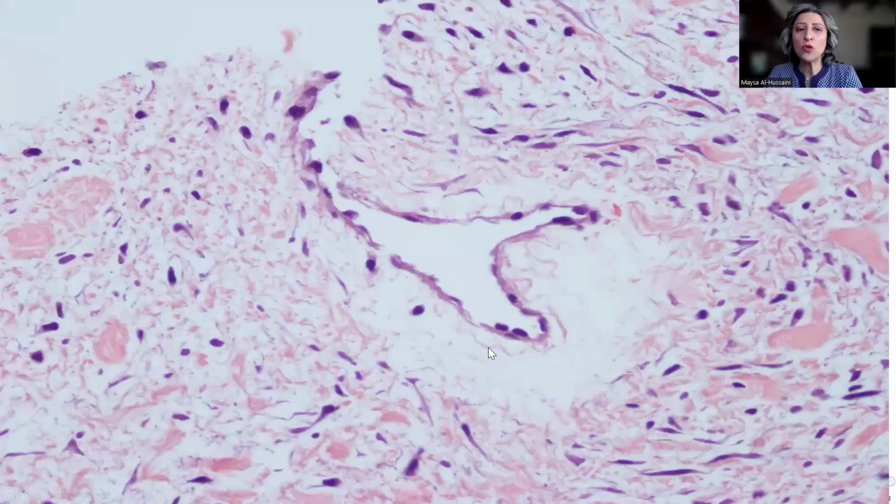One important clue that I find really useful in supporting the diagnosis of fibromatosis against the rest of the differential diagnosis is that there tends to be a formation of edema, this white space, because of edema around vessels, in particular arterioles, in fibromatosis. Try it. It's really a very useful small tip that can, in a way, support the diagnosis of fibromatosis. And again, the cells don't really come so close to each other. They tend to be separated, and then we have the collagen.